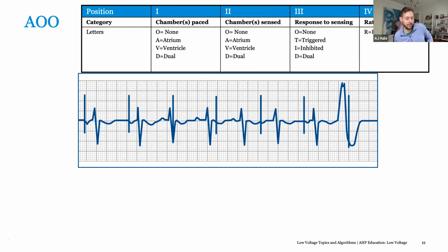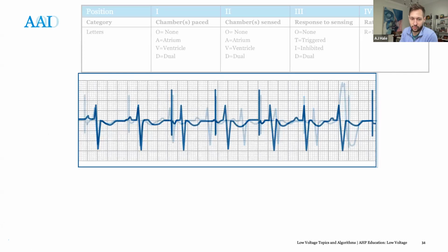I think sometimes it just makes physicians feel better when they have a BiV, and generally you want to have greater than 85% BiV pacing percentage to get any kind of benefit. You know, generally you want greater than 90 to 95%. So if they have a lot of AFib with RVR, you see some physicians turn on VVT or DDT to try to at least get something where they feel like maybe they're assisting the patient, and the BiV isn't just essentially a paperweight while they have those high ventricular rates. So you won't see it much. If you ever see it and you're wondering what's going on, just reach out and we can talk through it.